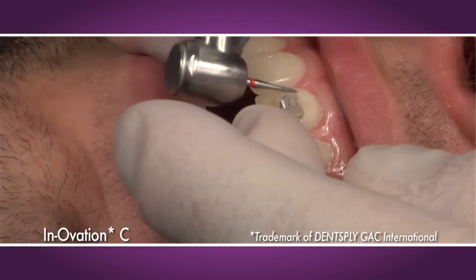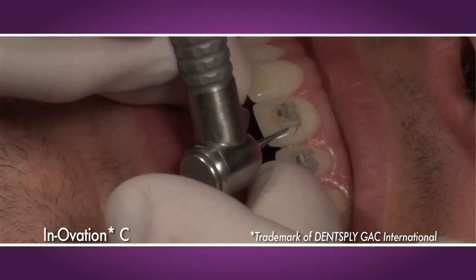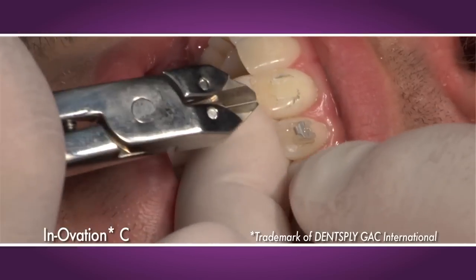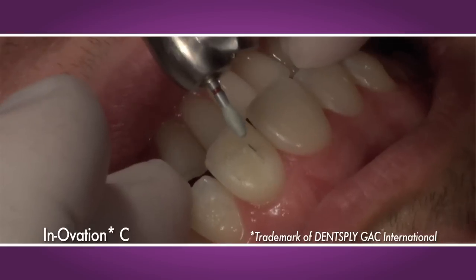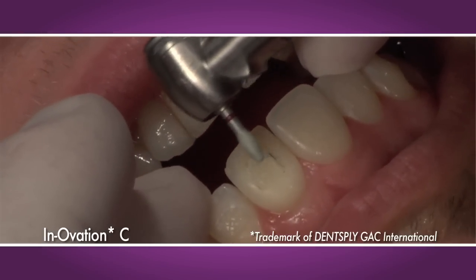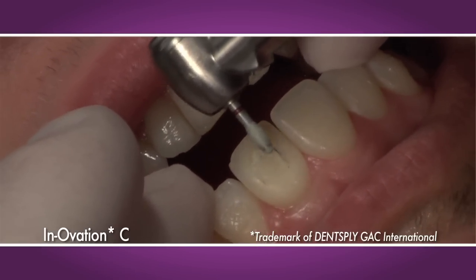Other aesthetic brackets require bulk adhesive removal prior to debonding, as well as the use of a mini-pin or ligature cutter to shear off brackets, causing considerable patient discomfort. Bracket fractures can be all too frequent, resulting in the use of a diamond burr, which can sometimes cause patient enamel damage.